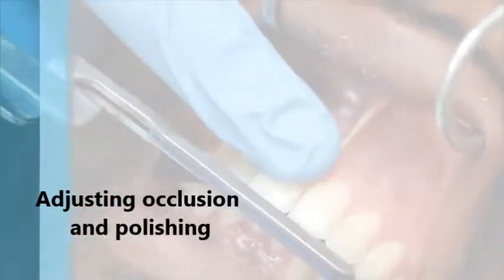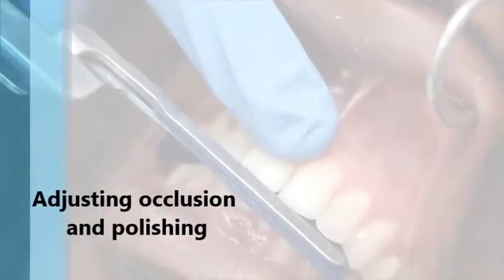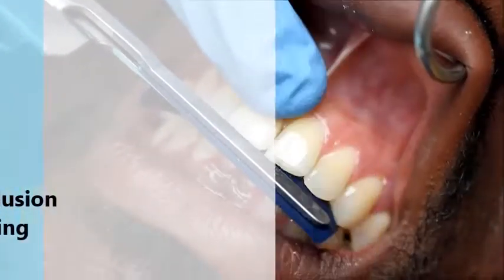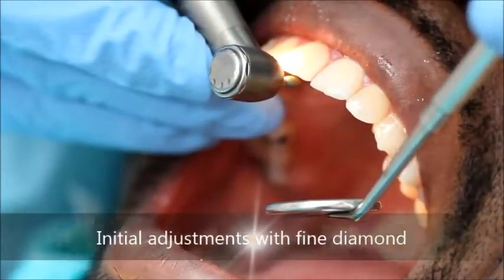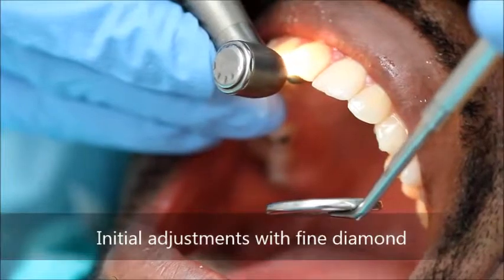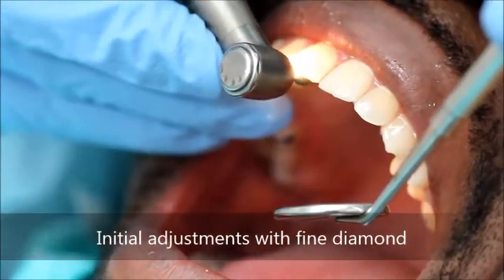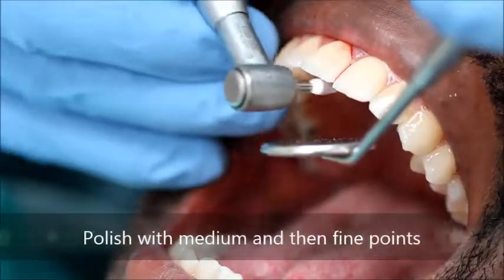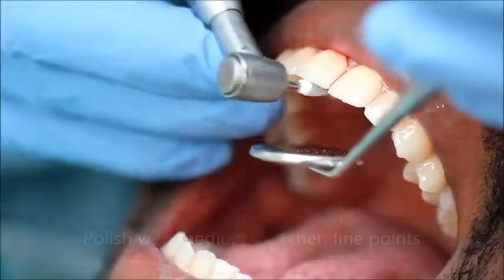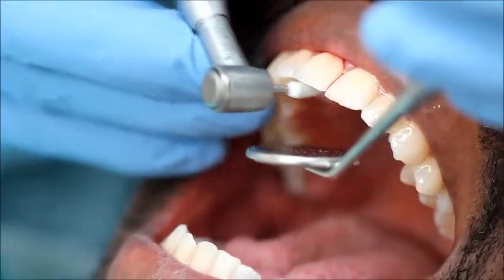Following cementation, the occlusion is adjusted. The patient is asked to bite in maximum intercuspation and excursive movements with articulating paper. Excess markings are first adjusted with a fine diamond with water cooling. Polishing of the restoration is then performed to reduce opposing enamel wear, smooth any micro cracks produced from the diamond, and smooth the restoration for patient comfort.